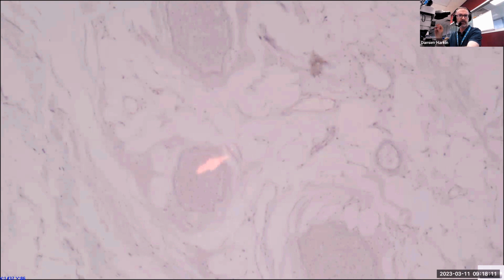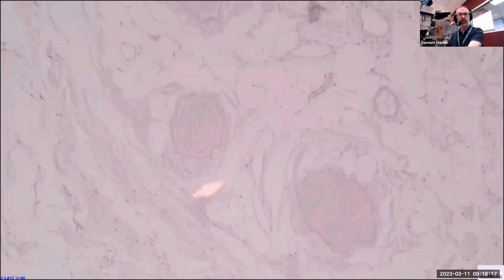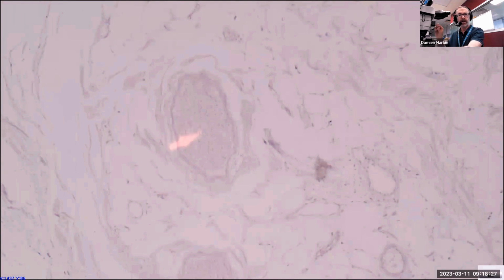Obviously, we haven't stained them up as well here, because this is not an H&E. We've actually got a counterstain of nuclear fast red, so it's not lighting those up particularly well. But you can see there are those nerve bundles that we just had a moment ago within that connective tissue, another nerve bundle here.